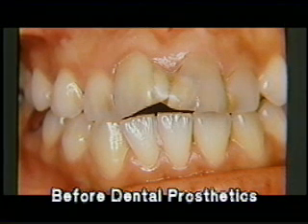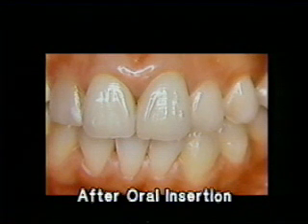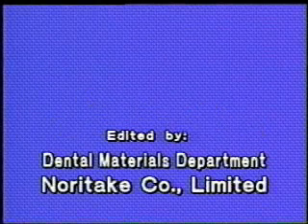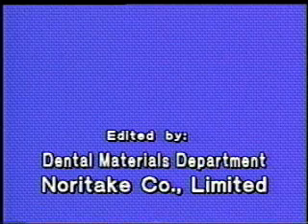Here is another case for the two central incisors and the two lateral incisors. The configuration has been well restored and the color shades are reproduced bright and vivid. We really appreciate your evaluation of the technique, and it is our hope that it will be a help for the improvement of dental techniques and will be the best prescription for patients to regain their smiles.